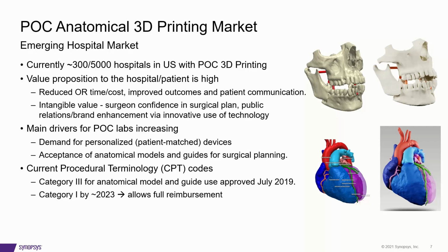So the main drivers for POC labs are increasing as well. There's more demand for personalized patient-matched devices or plans. There's more acceptance of anatomical models in general and guides for surgical planning. And another thing that's very important is the current procedural terminology, or CPT codes. These are the codes used for reimbursement.